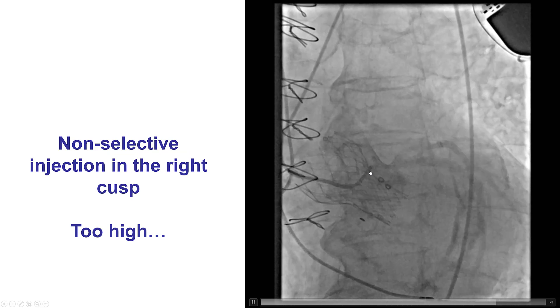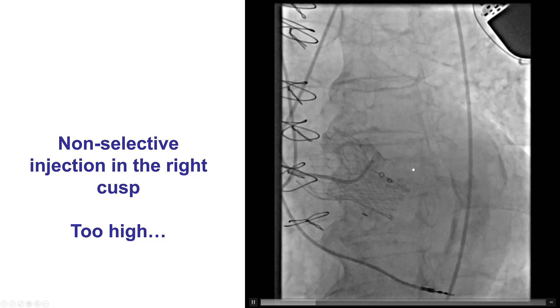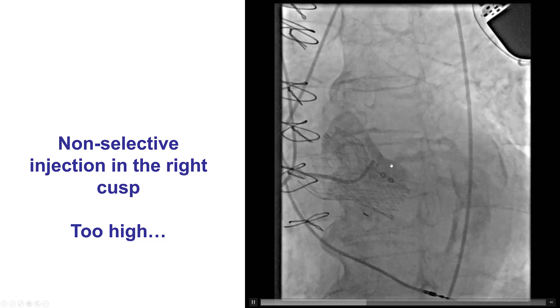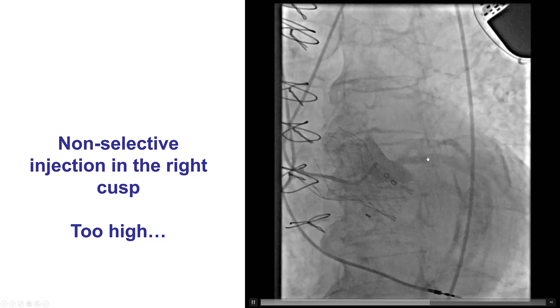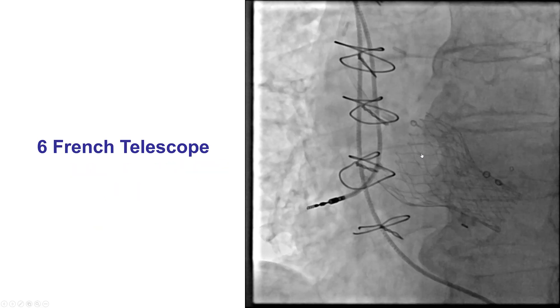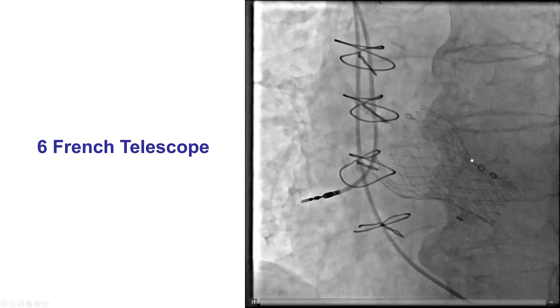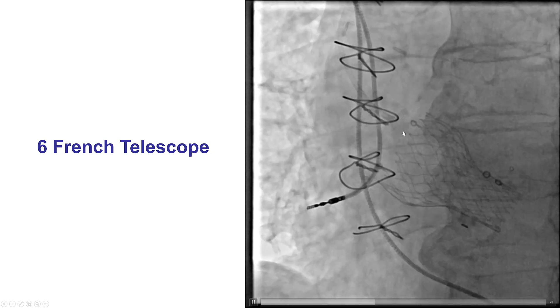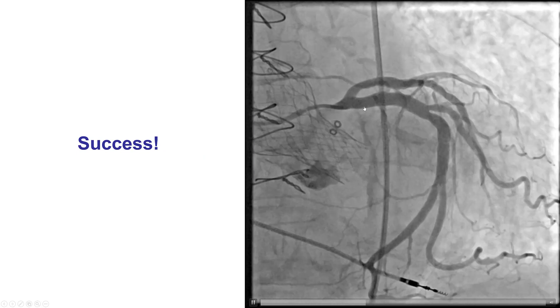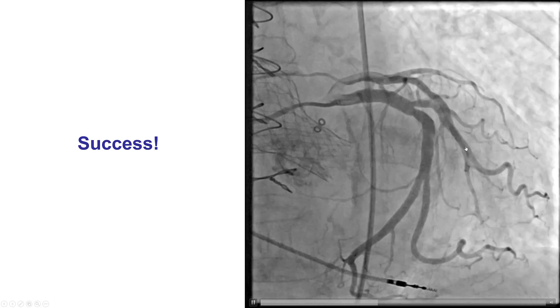Unfortunately, even with repositioning, the coronary catheter was still above the coronary ostium. One option would be to use a guidewire, but that would still make it difficult to advance the catheter all the way. The other option is to use a guide extension. Non-selective injection did not suffice because opacification of the coronary artery was suboptimal. So a 6 French guide extension was used going through the cells of the valve, and that allowed subselective engagement of the circumflex with good visualization of the coronary artery, which did not have any significant lesions.